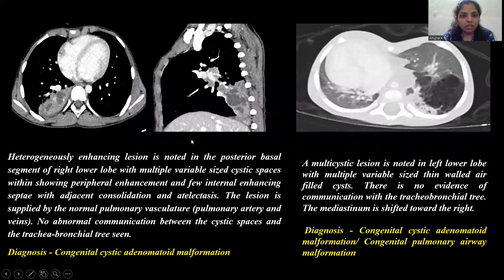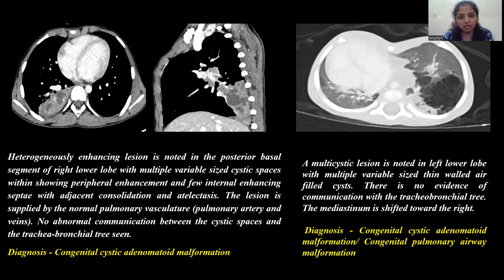The following images are contrast-enhanced CT images, axial and sagittal, showing a heterogeneously enhancing lesion in the posterior basal segment of the right lower lobe, with multiple variable-size cystic spaces within, showing peripheral enhancement and few internal enhancing septae, with adjacent consolidation and atelectasis. The lesion is supplied by normal pulmonary vasculature. No abnormal communication is seen between the cystic spaces and the tracheobronchial tree. Diagnosis of congenital cystic adenomatoid malformation was made.